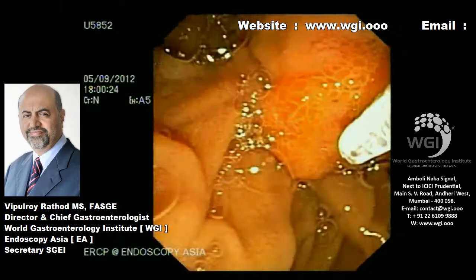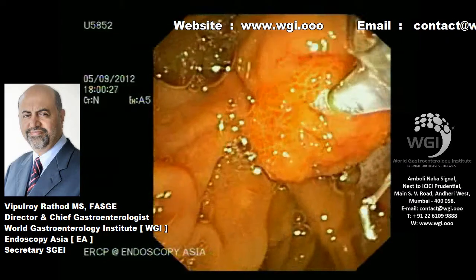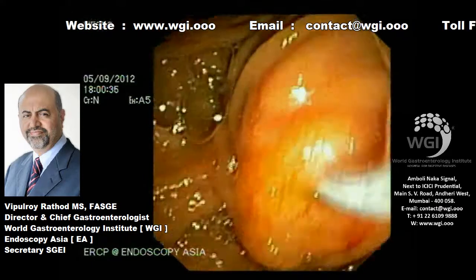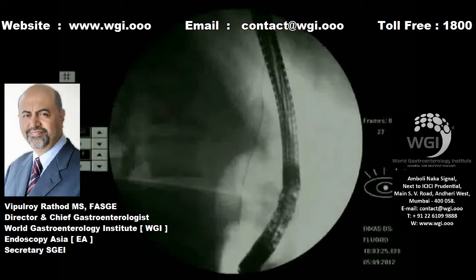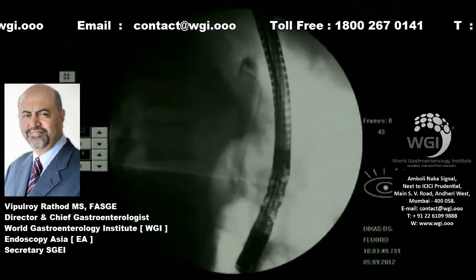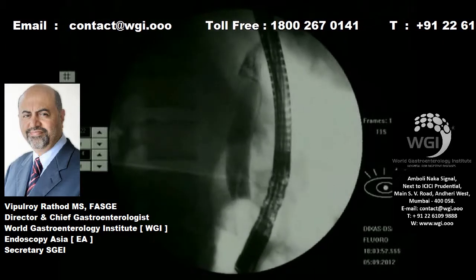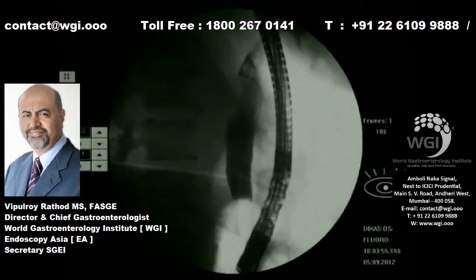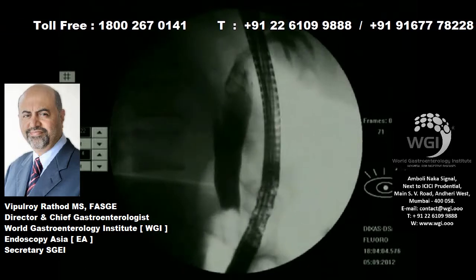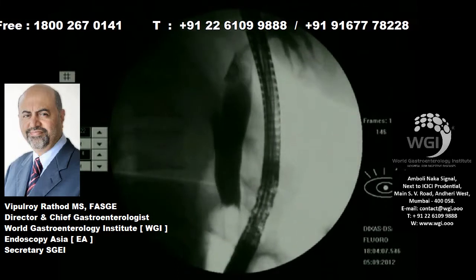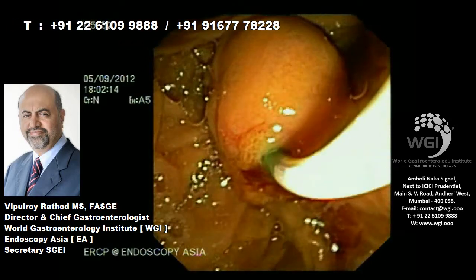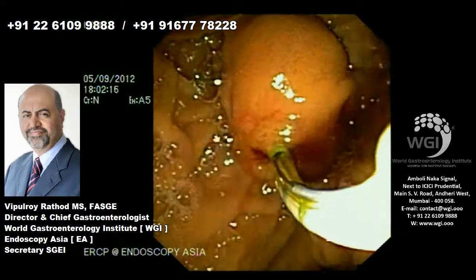Duodenoscopy revealed a very fleshy, bulging ampulla. We always try to cannulate the bile duct trans-opening rather than doing a pre-cut in such situations, because it can bleed. We are deep into the biliary ductal system, and then we inject contrast — you can see a pseudo-calculus filling defect at the level of the ampulla.